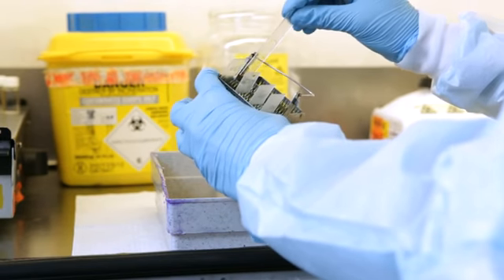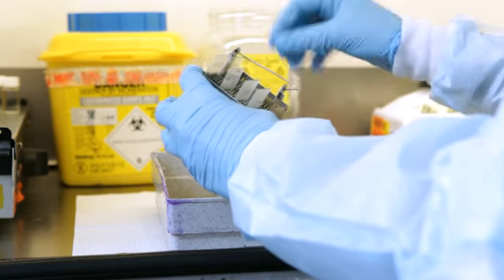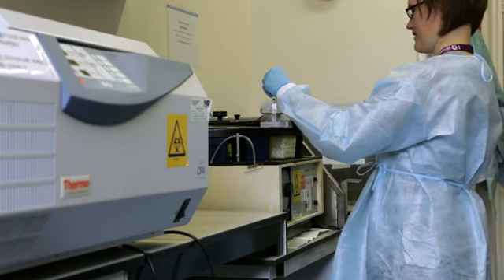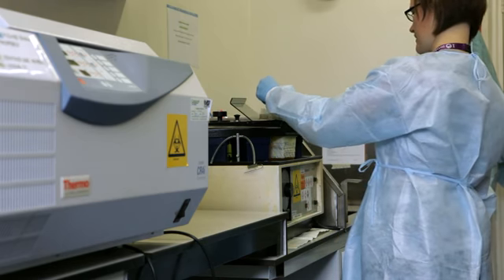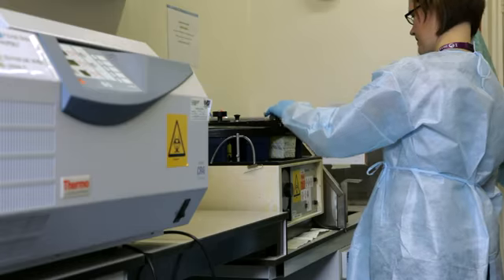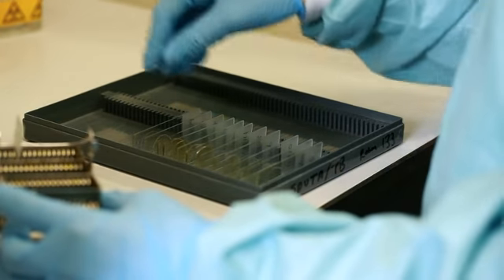The slides are placed in a cassette and loaded onto a staining machine, where they are stained with Auramine O. A positive and negative control slide is included on each run. The staining process takes approximately 35 minutes. Once air dried, the slides are ready to read.